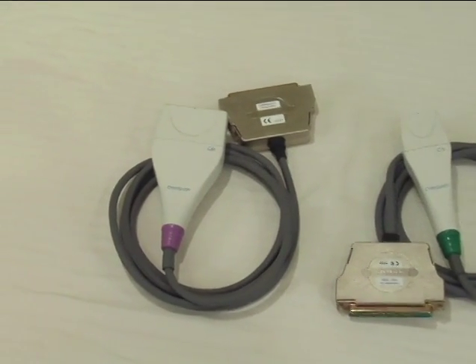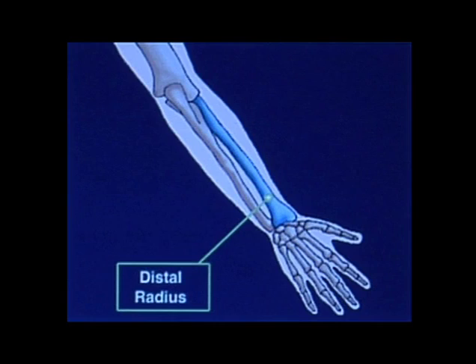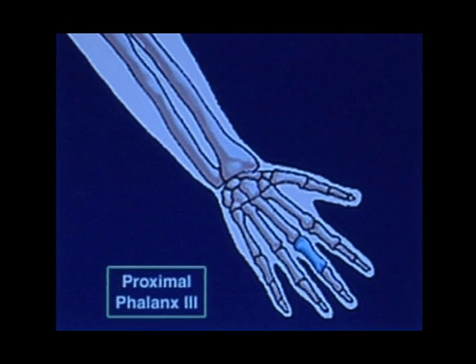The larger probe measures the SOS through the distal one-third of the radius — that's the bone that sits between the elbow and the thumb's side of the wrist. The smaller probe, which we won't be using today, measures the SOS through the proximal phalanx of the third or middle finger, as it is a little bit more difficult to maneuver and the distal radius should give us all the information that we need.